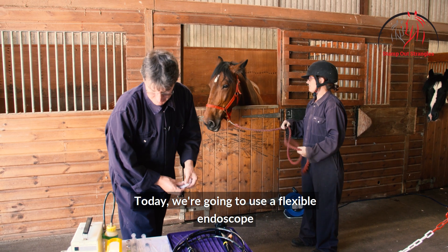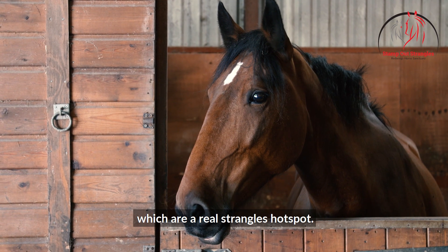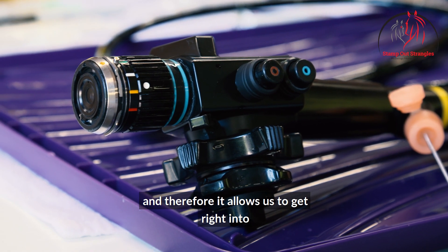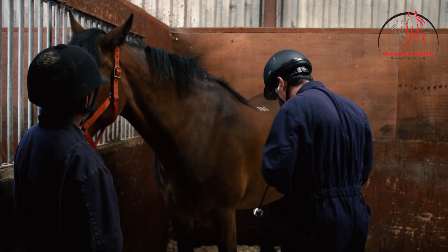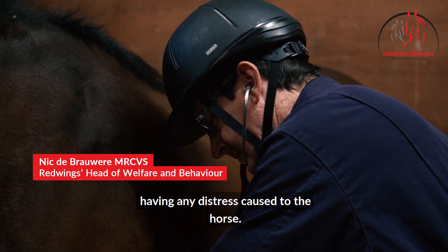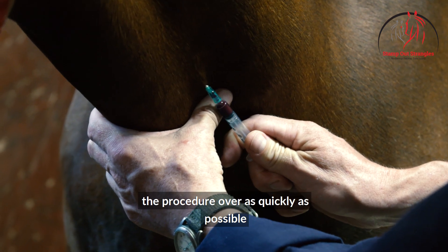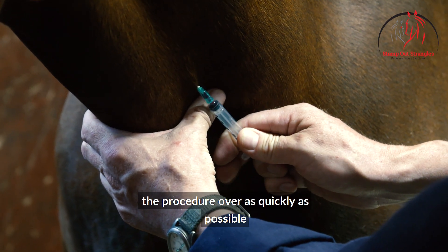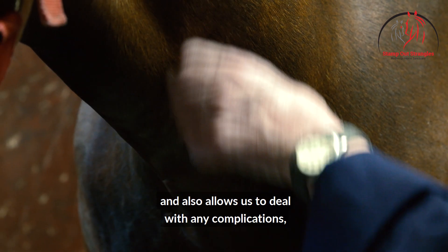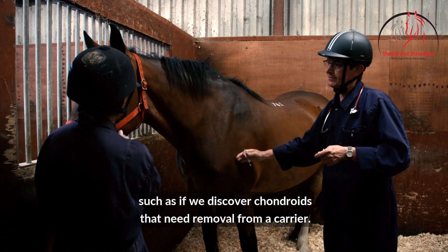Today we're going to use a flexible endoscope to access Chantal's guttural pouches, which are a real strangles hotspot. The endoscope is flexible and allows us to get right into the back of the head where the guttural pouches are, collect samples, and have a look without any distress to the horse. We're going to sedate Chantal because it allows us to get the procedure over as quickly as possible, be more accurate with the scope, and deal with any complications such as discovering chondroids that need removal from a carrier.